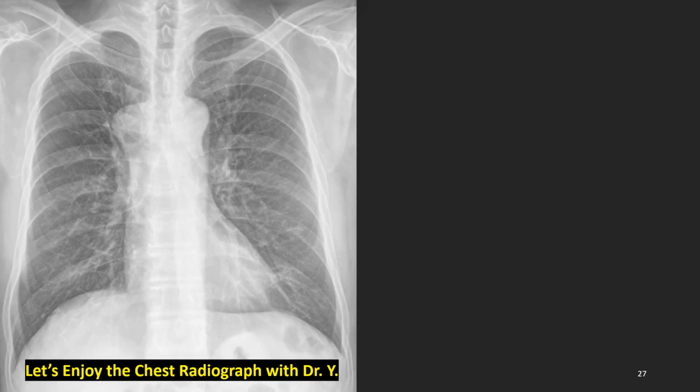How about this patient? Somewhat looks simple. Yes, paratracheal lymph node. Right paratracheal stripe obliteration. Right paratracheal stripe obliteration is always very important, like this, because we sometimes see here small cell lung cancer, tuberculosis lymphadenopathy, lymph node metastasis, and another lesion is lymphoma.